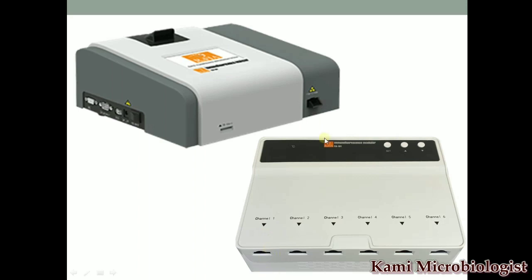Now after 15 minutes, what will you do? You will take it out, and then you will insert the strip into this machine. Once you insert it, some options will come, and there will be a start option as well. You will press it, and after a few minutes it will give you the report.